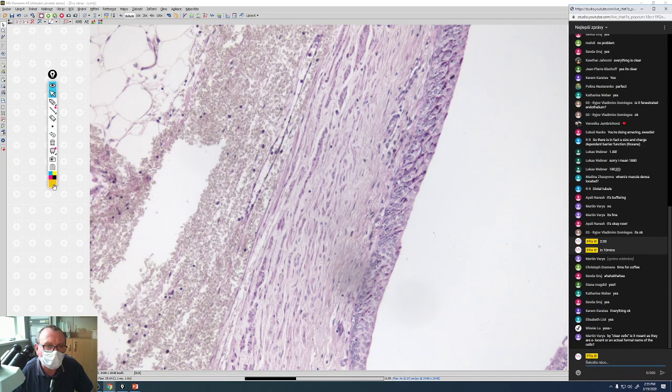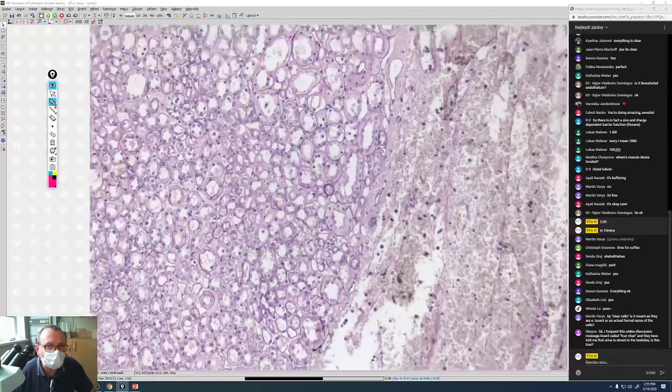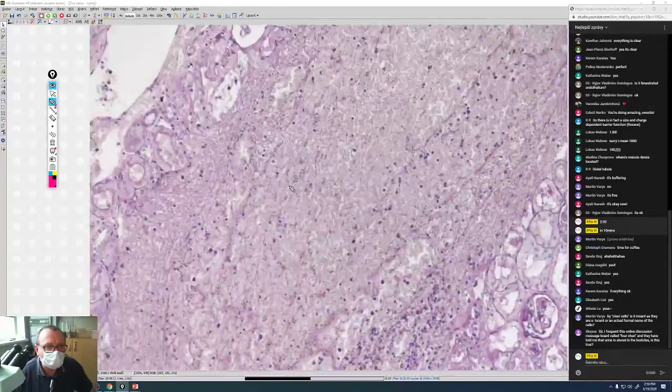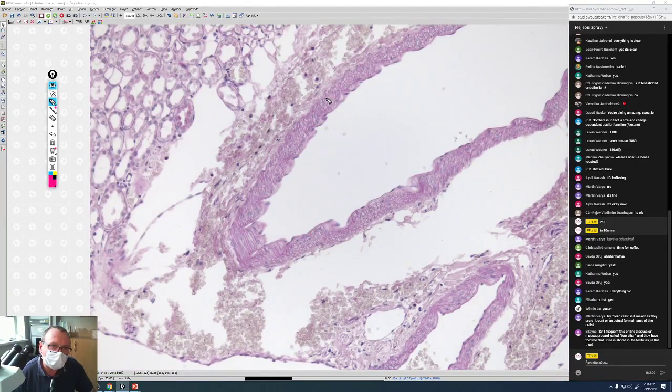Some smooth muscle is in the wall of this calyx as well, but much better smooth muscle is in the vascular wall, where, wait a moment, I'll find some artery, or here is better, and we can see reticular fibers in the endomysium around each smooth muscle cell. Just repetition, it doesn't belong to description of a kidney, but you hopefully know it from basic histology.